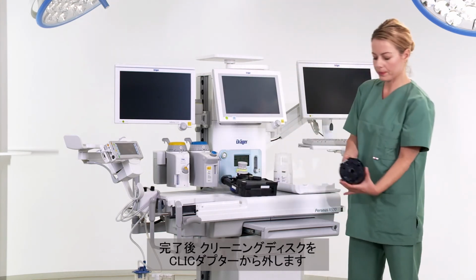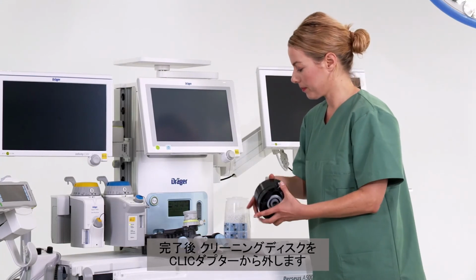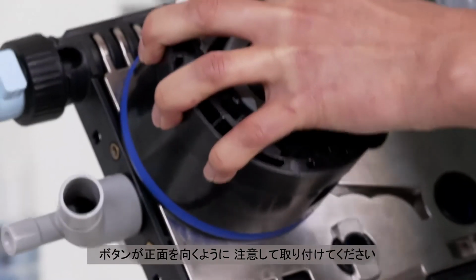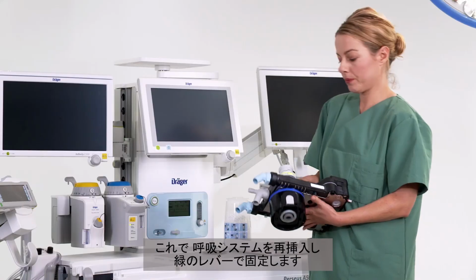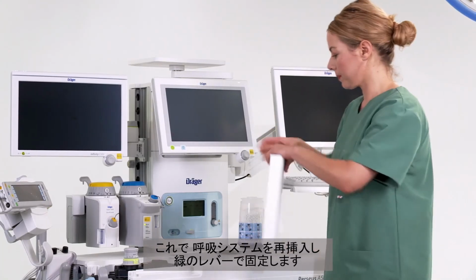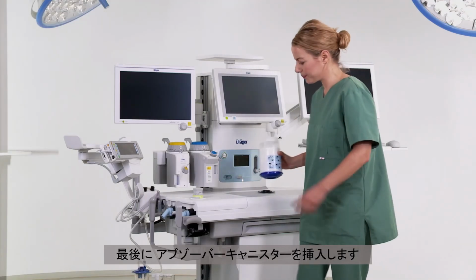After that, remove the cleaning disc from the click adapter and fit it back onto the breathing system. Pay attention that the button points to the front. The breathing system is now ready to be reinserted and locked with the green lever. Then fit the breathing system cover and latch it. Finally, insert the absorber container.